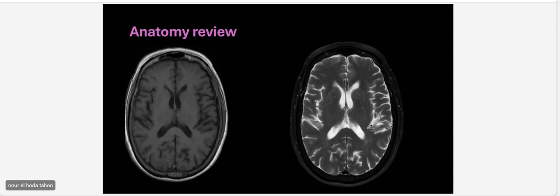Okay, let's go to the next cut. Now at the cut of the lateral ventricle, and this is a very important cut as well, you can see the frontal horn very well. You can see the body. You can see the posterior horn of the lateral ventricle.